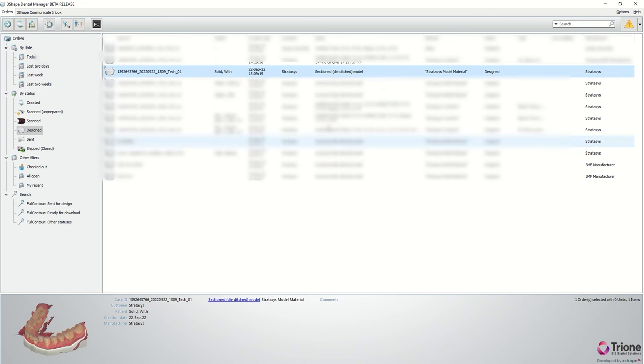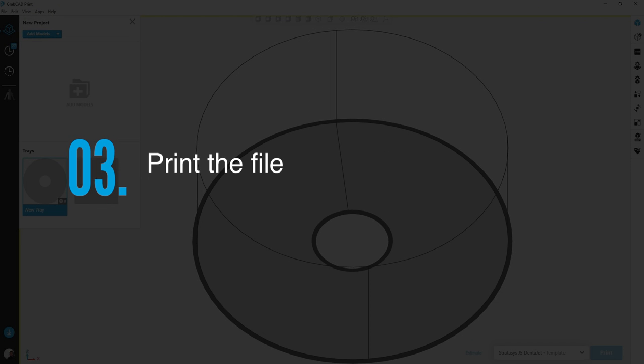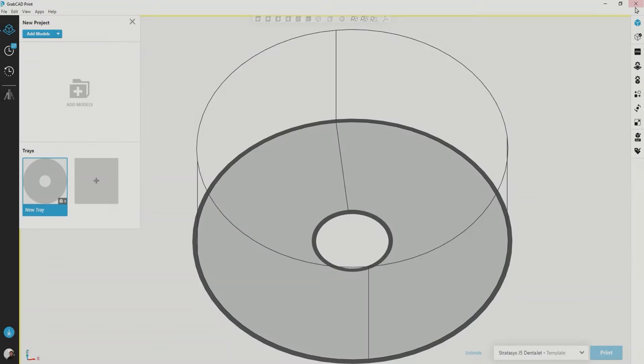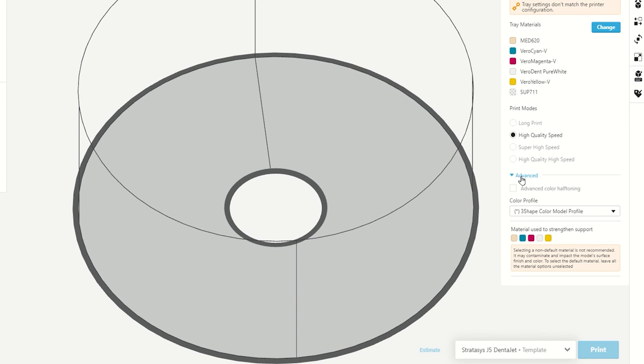Alternatively, you can click Shift F4 to open the same file. Verify you have all four color materials loaded in the printer and under Advanced verify the color profile is 3Shape Color Model Profile.